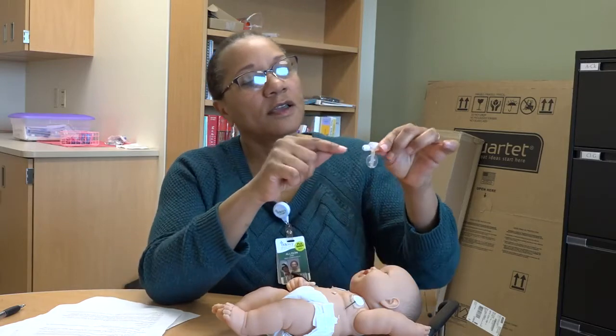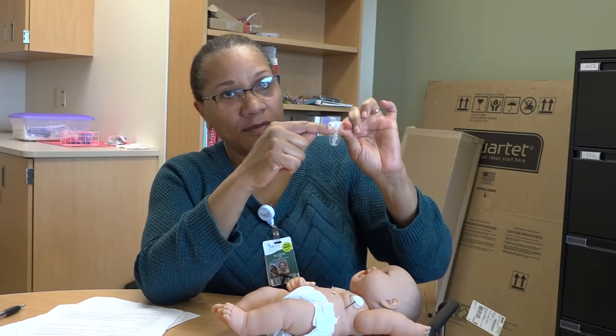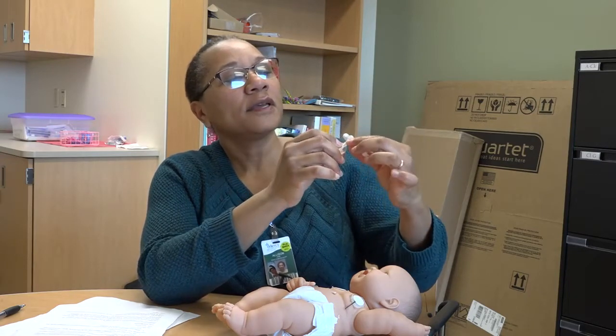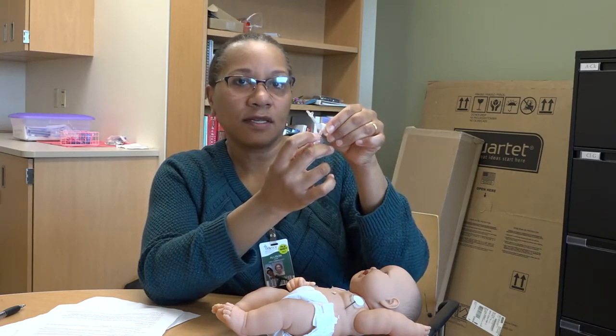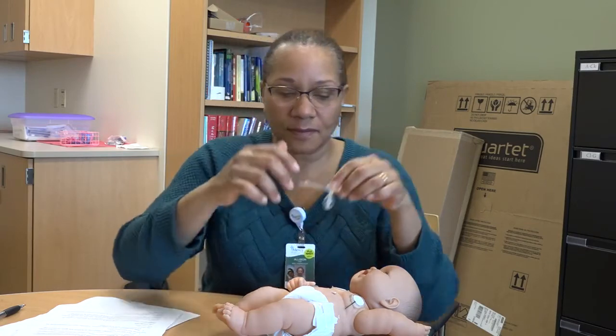So just think about a quarter, and do you think that you could slide a quarter between the bottom of this and your baby's skin, and can you see a little bit of this white line? And that lets you know that your fit is appropriate, okay?